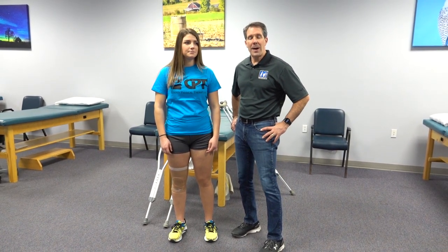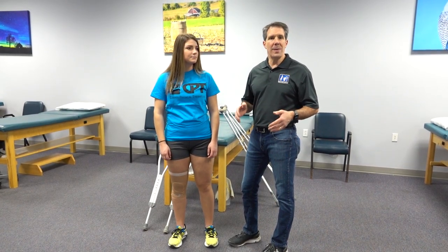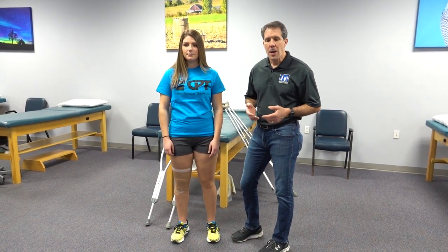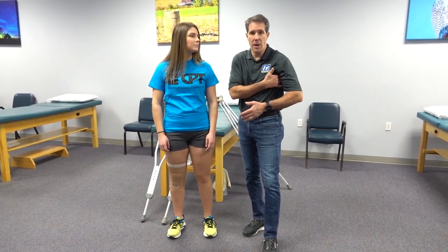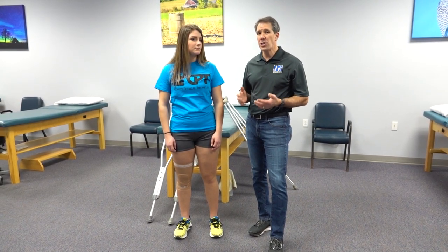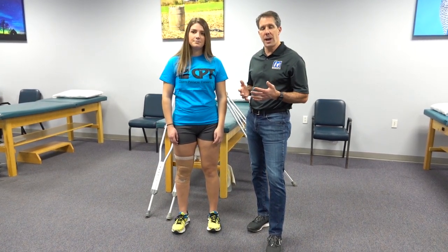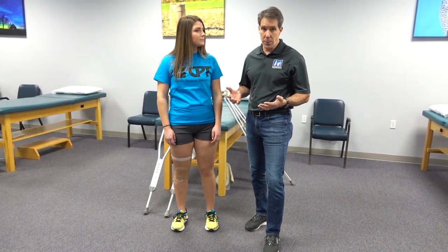Hello everyone, this is Paul from OrthoEvalPal. Today I want to talk about proper crutch fitting. Oftentimes you may end up in the emergency department, or maybe you've injured yourself and you're borrowing somebody's crutches and you really don't know how to fit them appropriately. One of the big misunderstandings about crutches is that you need to put pressure in the armpit — we don't want to do that. Many people injure themselves the first time they use crutches because they just haven't been instructed on how to use them appropriately. So we'll be doing a little session today on how to fit your crutches appropriately, and then we'll do another video on how to walk with them appropriately.